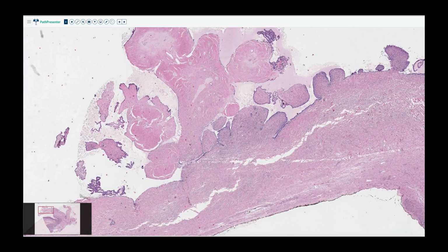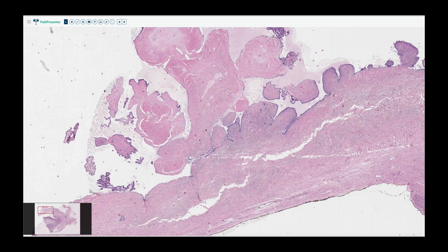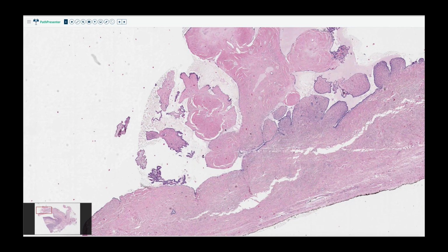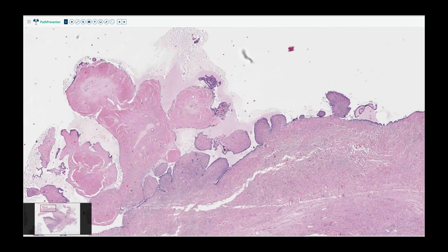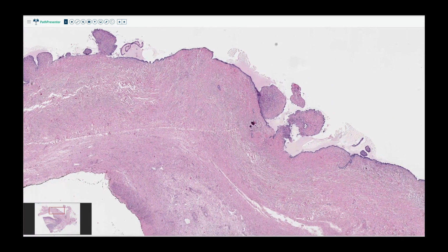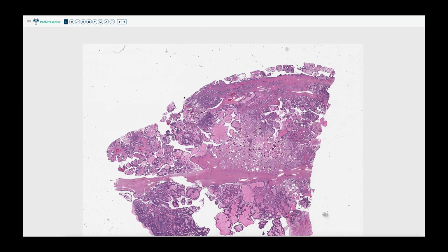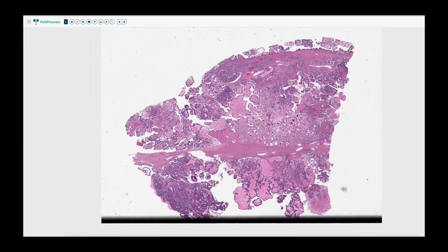The final diagnosis for this does say that it had focal proliferation, which means someplace else in the case it likely had areas that more closely resembled a borderline tumor. But we're starting out at the simplest end of the proliferation. So now we'll move on to the next slide. And this is a serous borderline tumor with some more interesting things going on in it.